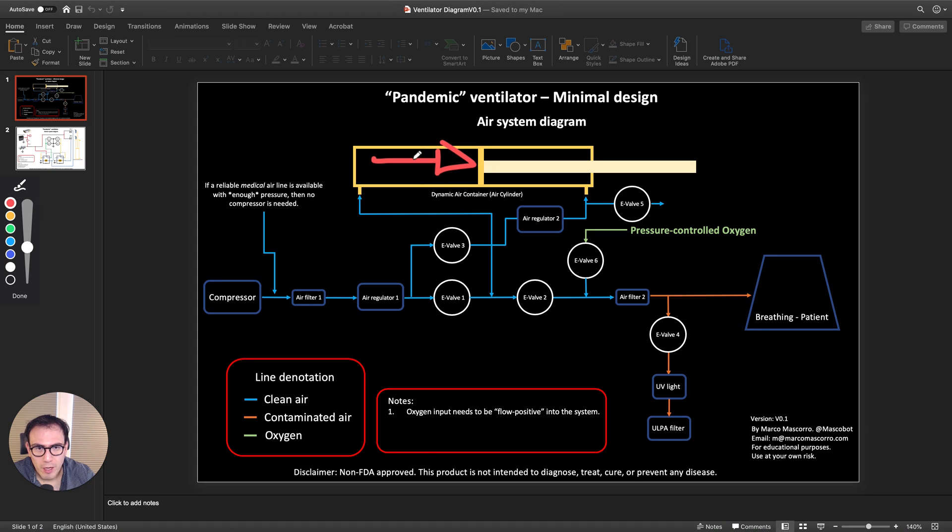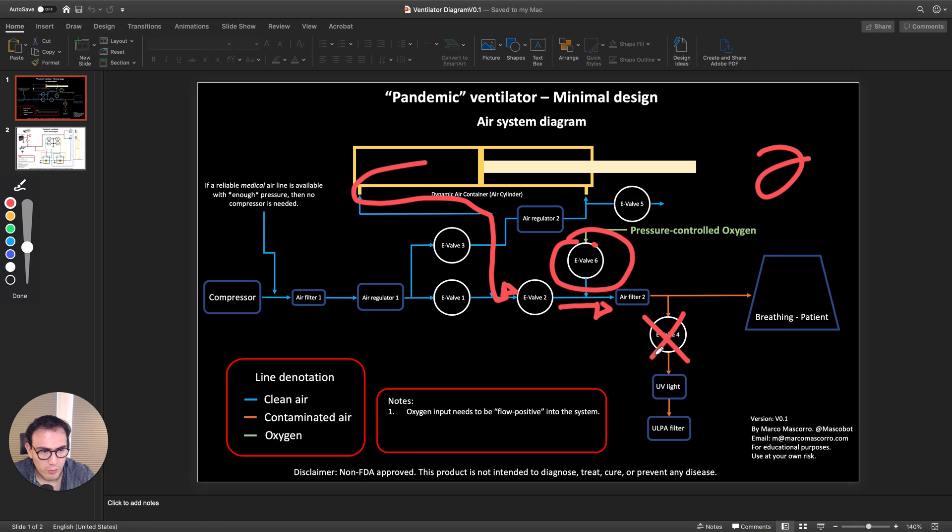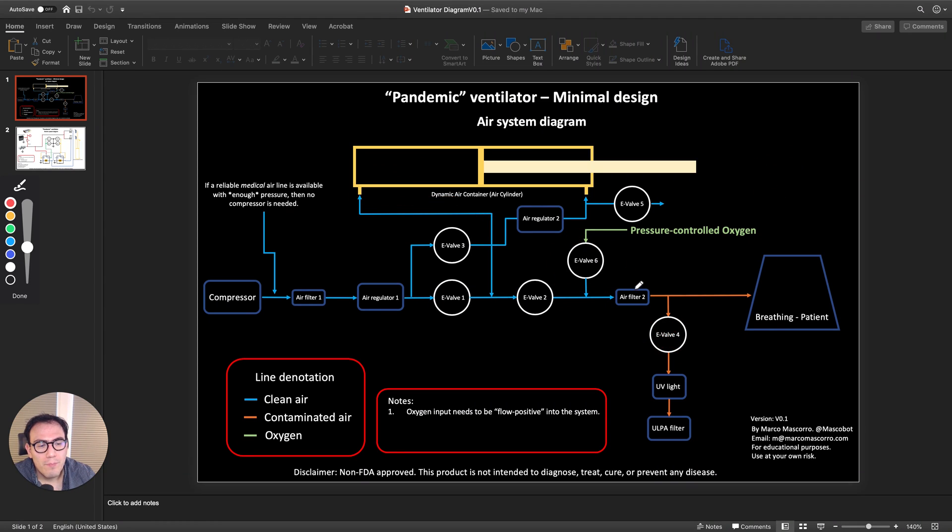The air starts flowing in this direction, filling up the tank. As the tank fills, it pushes the cylinder all the way up. There is a switch up here — when the cylinder reaches the top, it clicks the switch, telling the system it's full. At that point it closes this valve, opens this one and this one, so the air starts flowing toward the patient.